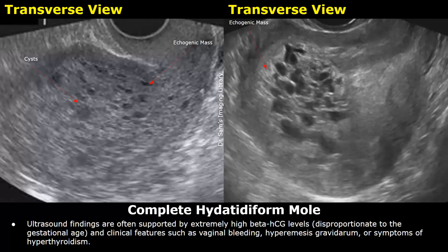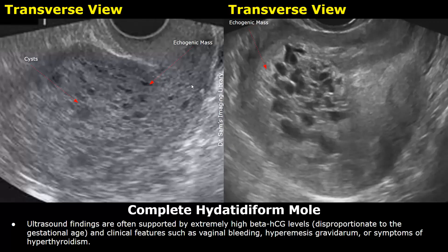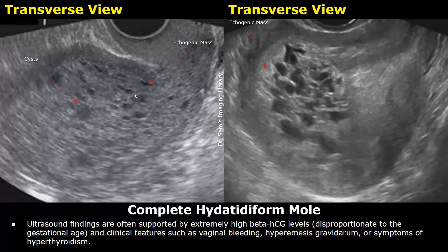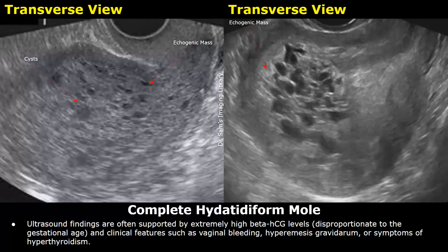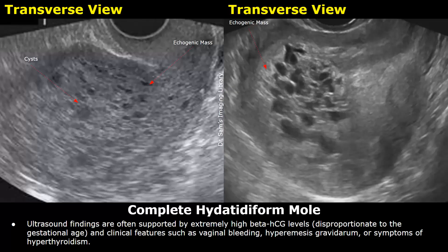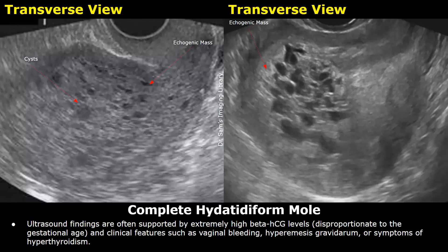In this condition, no embryo is formed and no fetal parts are seen. Instead, the uterus is filled with an abnormal benign mass. Ultrasound findings are often supported by extremely high levels of beta-hCG, and clinical features include vaginal bleeding, hyperemesis gravidarum — which is extreme morning sickness — or symptoms of hyperthyroidism.